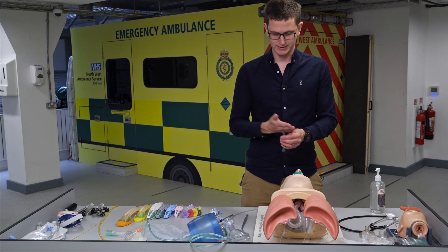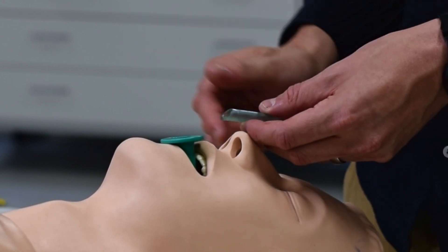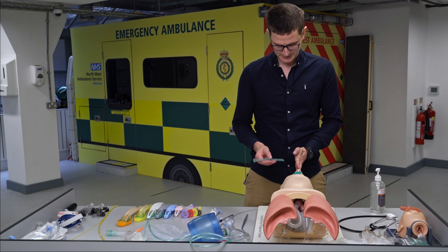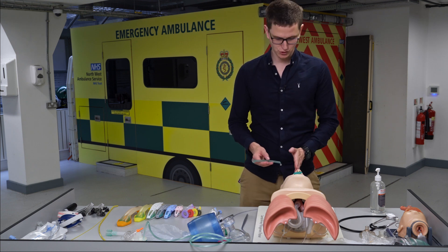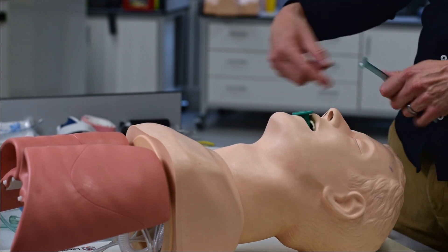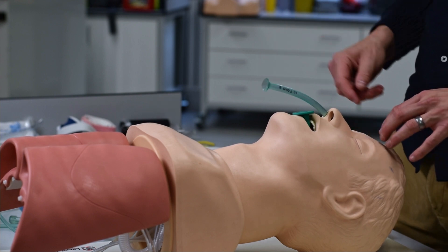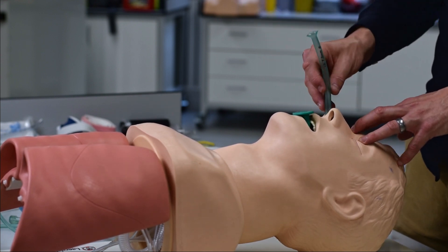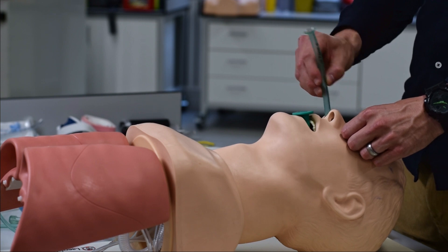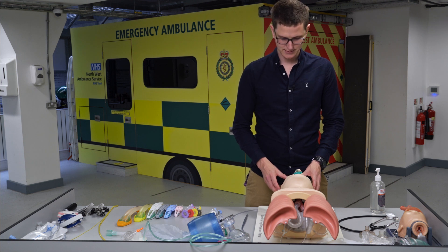How do you insert the NPA? There is a bevel. The bevel should face towards the septum of the nose because of the blood supply to the nose. You want to aim straight down to the back of the head — not upward as people sometimes do thinking that's how the nose travels. The nose travels straight down. Pull back the nose a little bit, get it in, and push straight down.